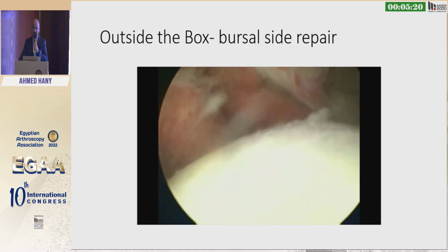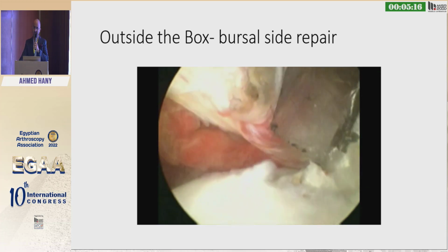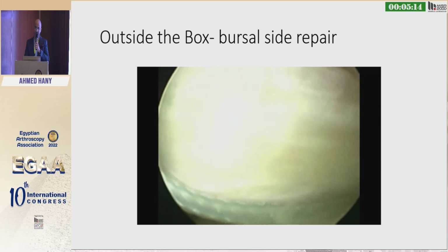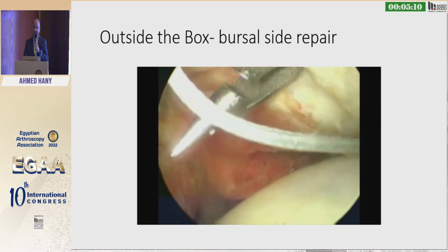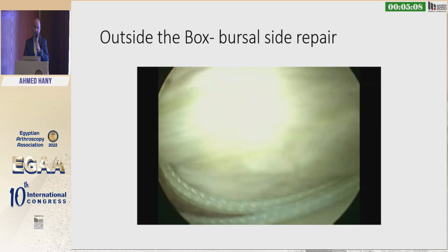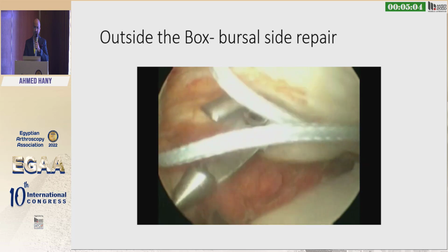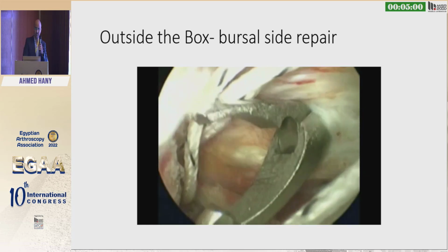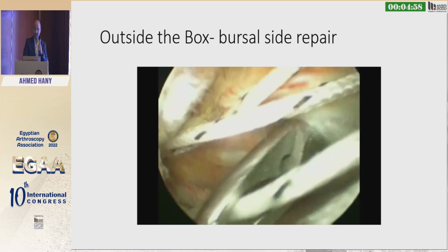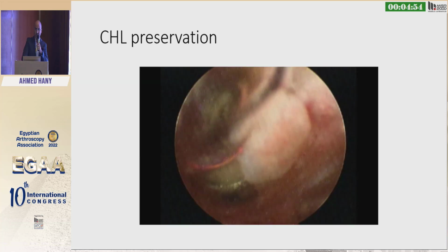I don't see that I need it every single time, but sometimes if you have a massive cuff repair, this space is open, so you might do it as well. It might be easier to do it this way. And I pass the same kind of sutures and check my repair at the end.